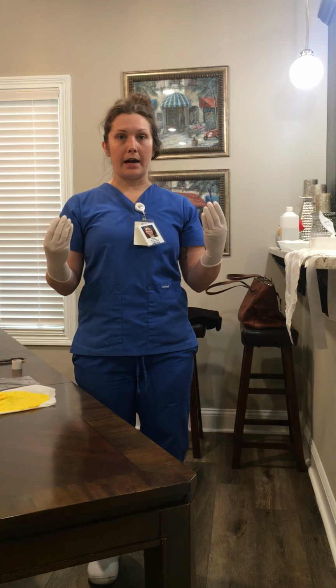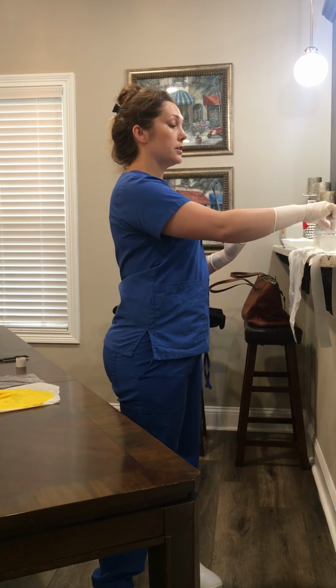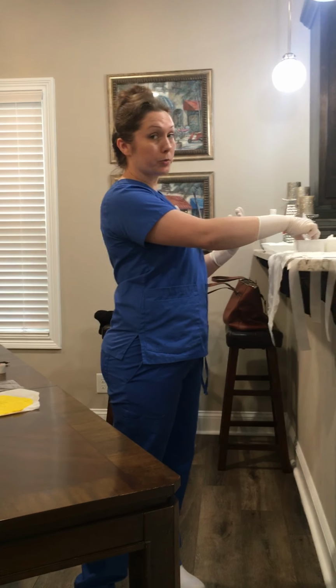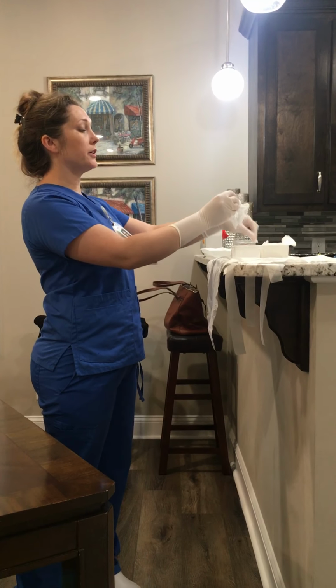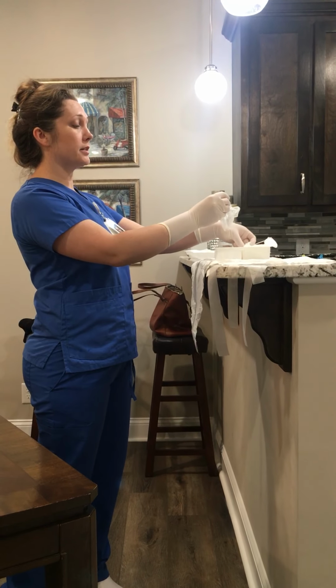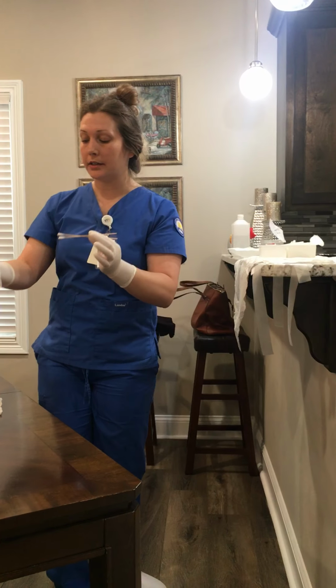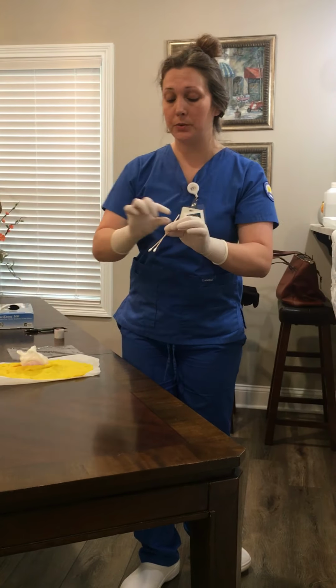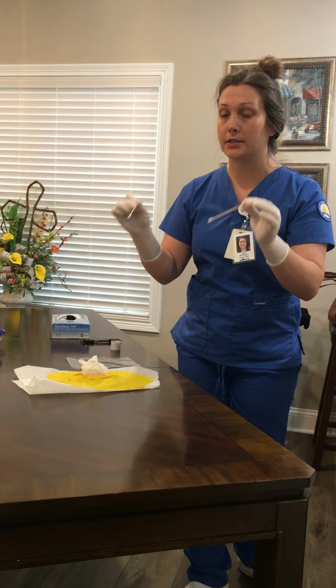So now it's time to pack the wound. I'm gonna get a piece of gauze wet in my normal saline and I'm gonna fluff it out, okay? I'm also gonna grab my 2 cotton tip applicators that are in here to help me pack the wound. So I'm gonna come over here, place it in my wound, making sure my gloves do not touch the wound. That's why I have these cotton tip applicators to help me.